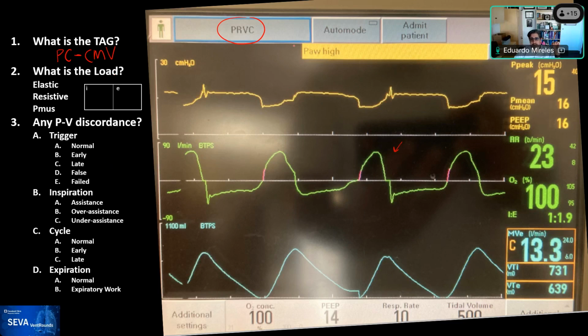And Ariel is bringing up another important point about this mode that has fooled some caregivers at the bedside, and actually in some of our VentRounds. They see the name Auto Mode up here, but it's not lighted. It changes color to green when active. So this is just PRVC, even though this tag is here, and you can activate Auto Mode by clicking it. That's not the mode right now.